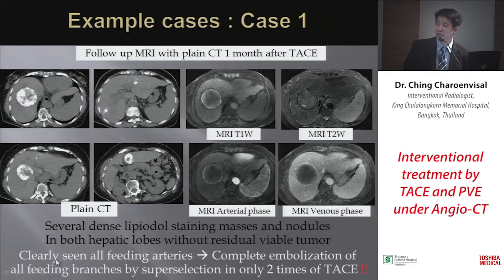In this case, we can clearly see all of the feeding arteries, so we can complete embolization of all feeding arteries in only 2 sessions of TACE.